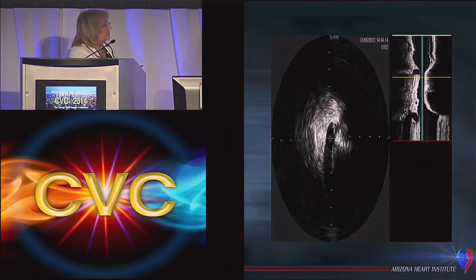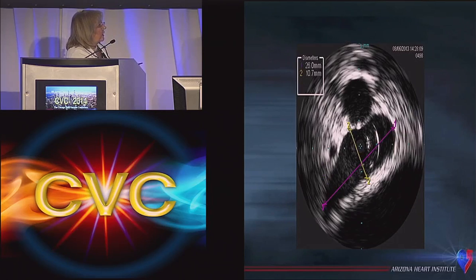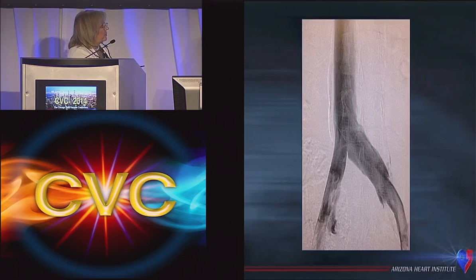So when you do the IVUS, you can see all this fibrotic tissue, and the narrow AP diameter, even though it's very wide side to side, is very tight front to back. And that will allow you to anchor a stent in here without fear of migration when you put it in the IVC and anchor it down into the external iliac. So we did, in fact, choose a 24 millimeter stent in her and deployed it after these diagnostic IVUS images with the 8 French, and she had one of the fastest recoveries from a symptomatic May-Thurner that I've ever seen. It was within 48 hours, her leg was feeling good to her, and her swelling was diminishing.